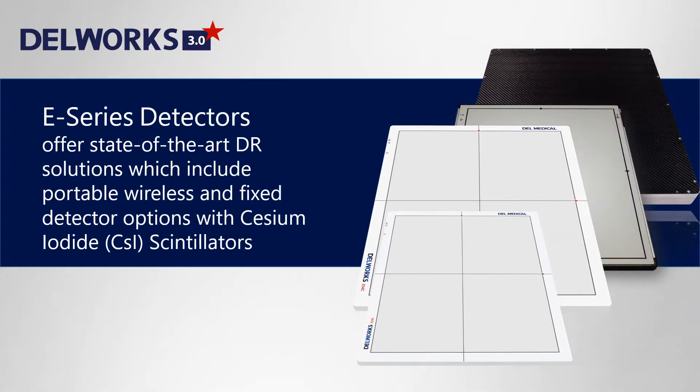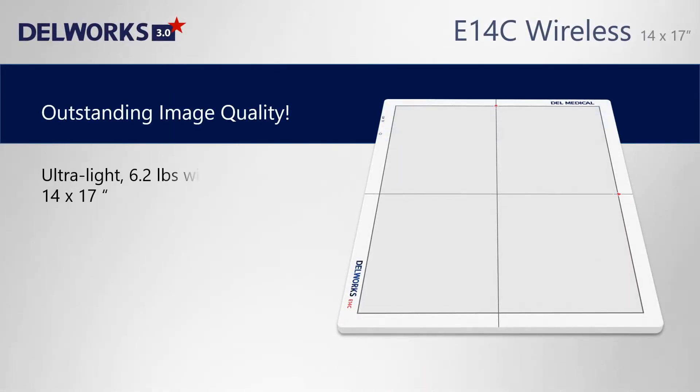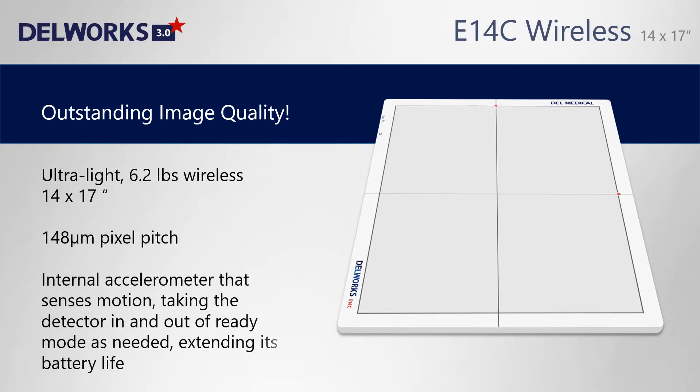DellWorks is compatible with your choice of cesium fixed or wireless flat panel detectors. The premium E14C 14x17 wireless detector is just 6.2 pounds. It provides outstanding image quality and wakes automatically from standby mode, extending battery life.